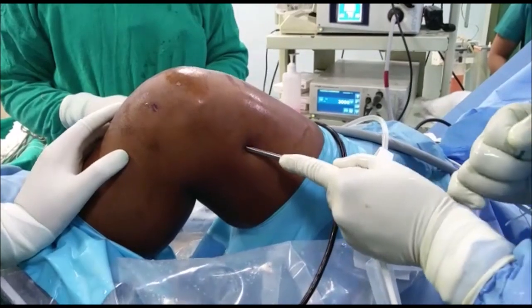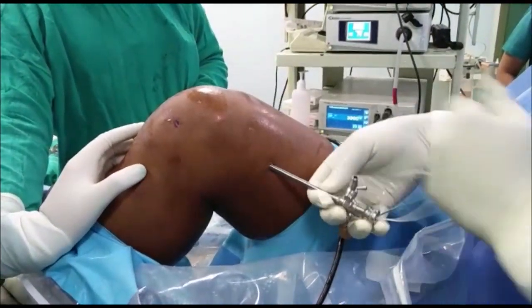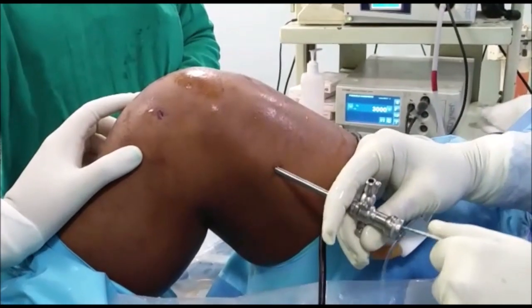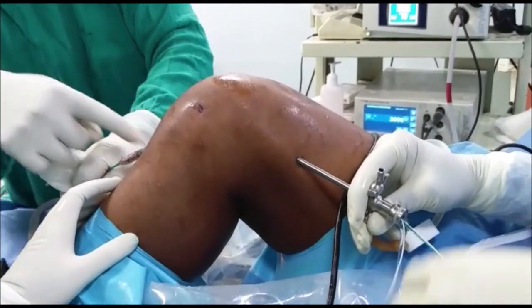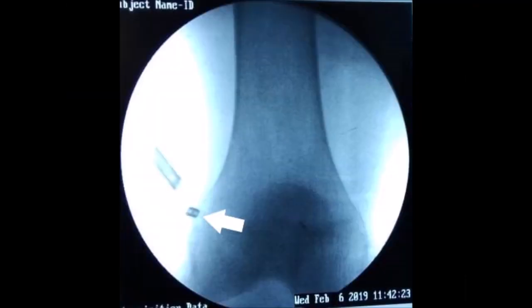Step 3: The sheath is advanced along the sutures through the soft tissues until it reaches the lateral cortex of the femur. Step 4: Once this is achieved, the graft is pulled down from the tibial tunnel. The cortical button comes out of the sheath and flips against the lateral cortex of the femur. This can be confirmed on arthroscopy by return of marks on the loop of the cortical button to the femoral aperture level, or by image intensifier.